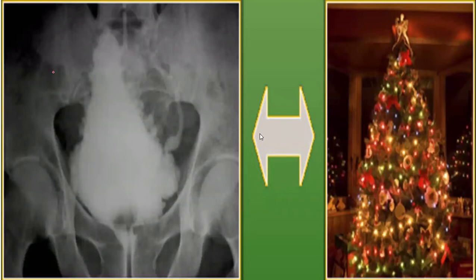But generally, the urinary bladder, if it is filled, is supposed to look a certain way, normally it is filled that way. But look at this, it is inverted, as if the tip, the apex, is here already. So it's an inverted one because there's a problem in this urinary bladder. So it's like a Christmas tree.